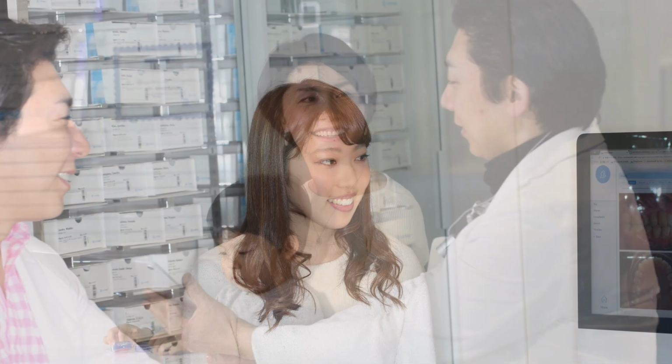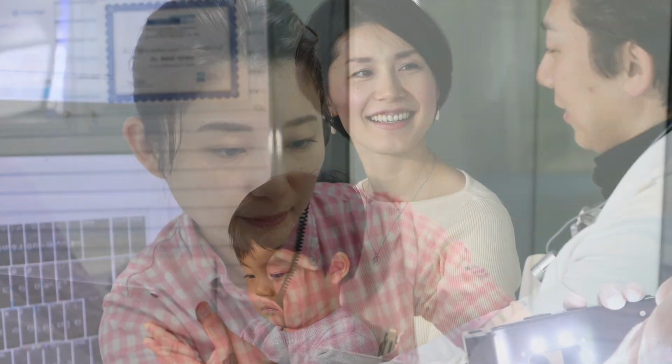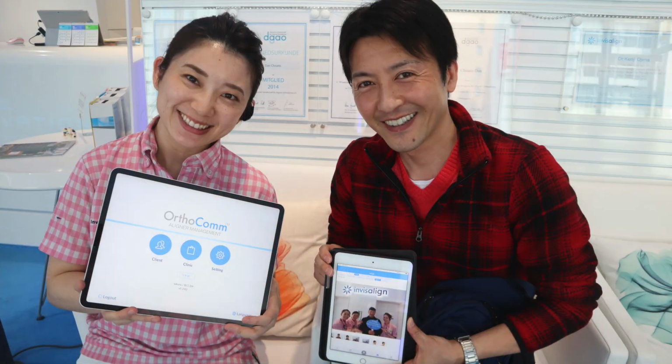But the most important thing here is that it allows you to manage a tremendous amount of dynamic data in a way that works not only to better your own treatments, but make your treatments at your clinics more attractive to future patients.